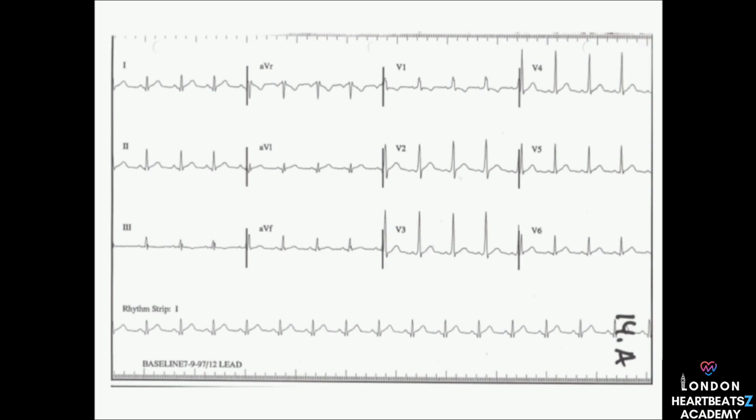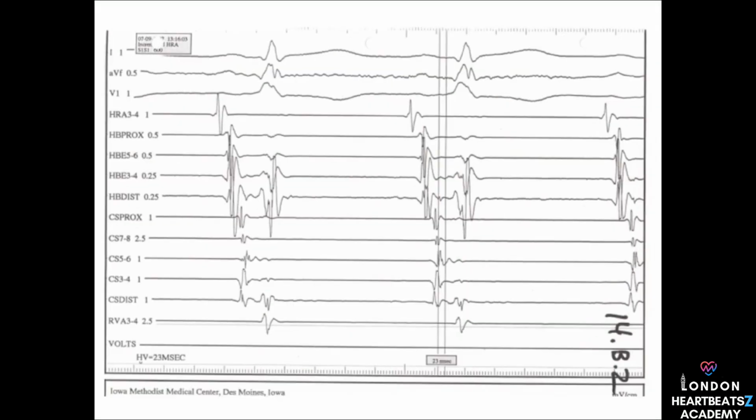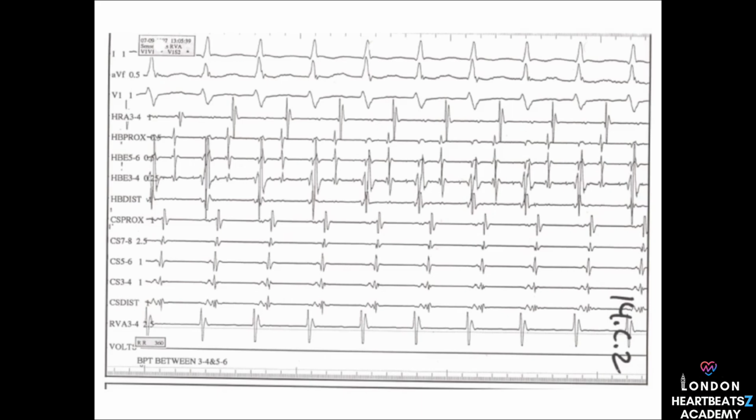Figures 14B1 and 14B2, those are the intracardiac electrograms before ablation, and the earliest ventricular wave is happening between coronary sinus catheters 3, 4, and 5, 6, which confirms that left lateral pathway. Okay, so we're zeroing in on that pathway. What happens next? Figure 14C1, that's a 12-lead ECG during orthodromic AVRT. Notice how it's got a narrow QRS complex, looks really different from the ECG in 14A. Figures 14C2 and 14C3, those are the intracardiac electrograms during orthodromic AVRT, and they're confirming that left lateral accessory pathway. Okay, so we're seeing the tachycardia, and we've confirmed the pathway.